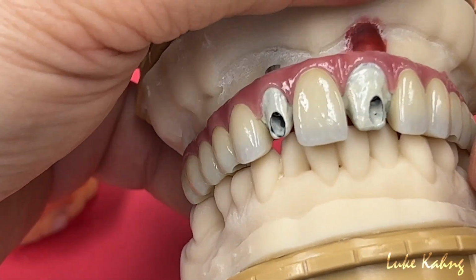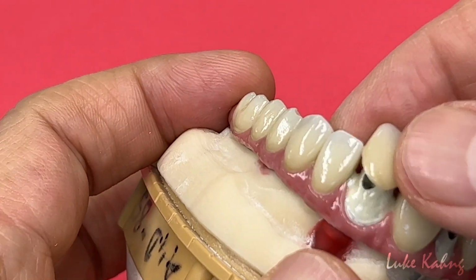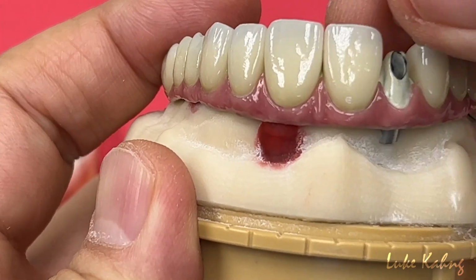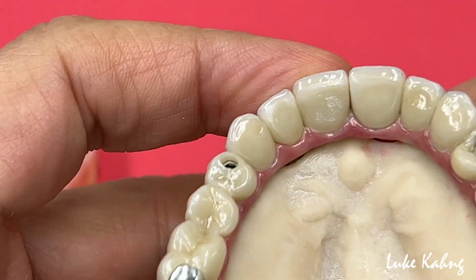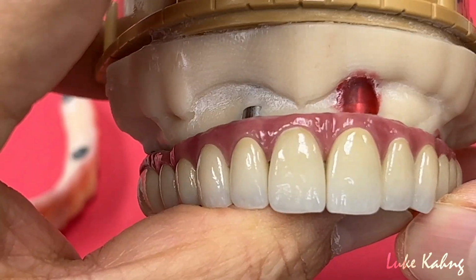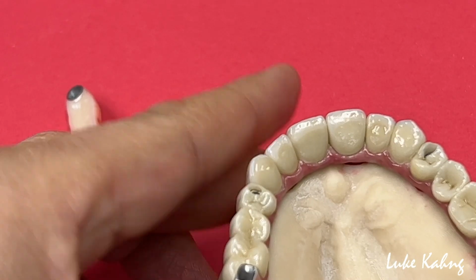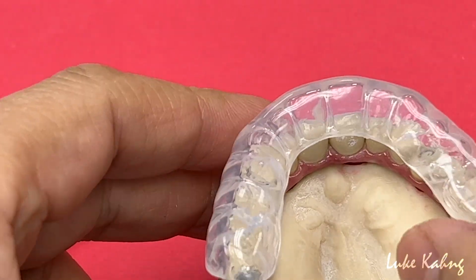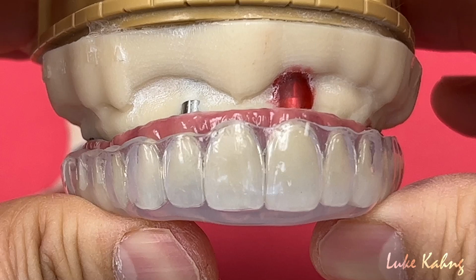This is the final, the aesthetics. And also, maybe the doctor will temporarily cement with this. Here too. Okay. Now this model is finalized. Great aesthetics. And then we fabricate the top of this, so the patient can do it.